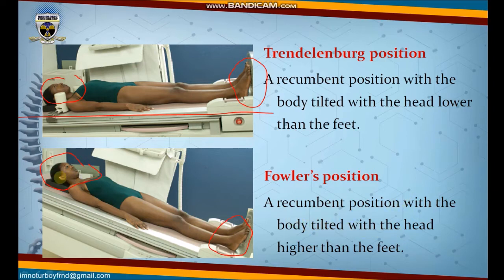So it could be that the patient is, for example, in this illustration, in which the body of the patient is straight, or if the patient is in his or her hospital bed, it could be that the patient is at an angle of 45 degrees from the bed. The patient is lying down there. Or it could be that the head portion of the bed is tilted up to 90 degrees. That can still be considered as Fowler's, or particularly that is a high Fowler's position.